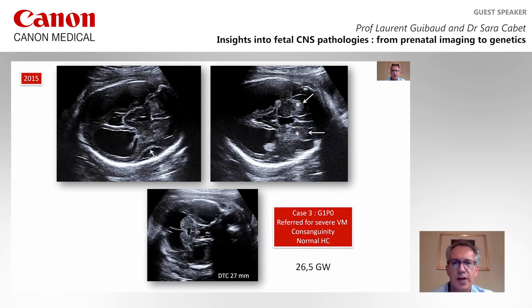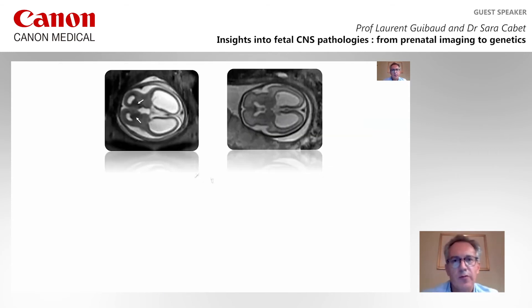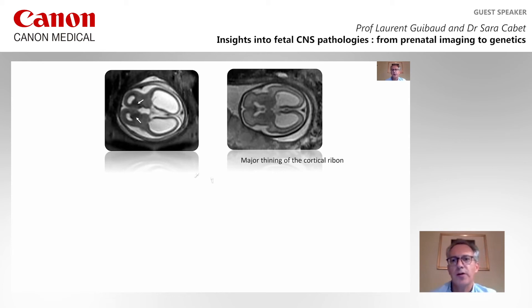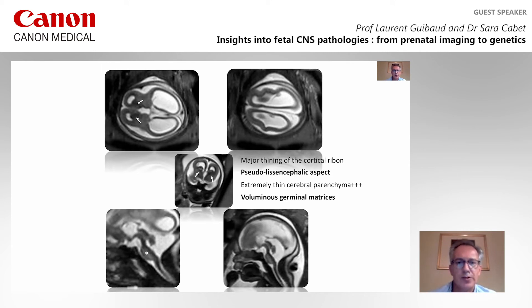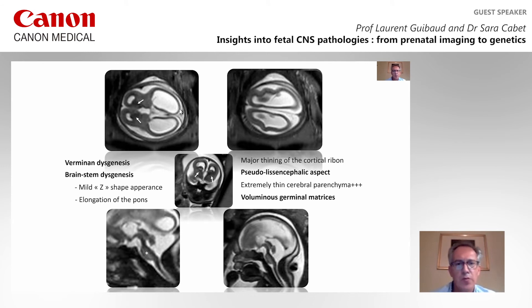There is hypoplasia of the cerebellum, and there were also very small eyes on both sides. On fetal MR, the findings were confirmed — you can appreciate the germinal matrix, and there is a very abnormal Sylvian fissure compared to a control at 27 weeks of gestation. There is major thinning of the cortical ribbon, pseudo-lissencephalic aspect, extremely thin cerebral parenchyma, and voluminous germinal matrix. On the infratentorial structure, there is vermian dysgenesis and a very specific brainstem dysgenesis with a mild Z-shaped appearance but a very specific elongation of the pons.